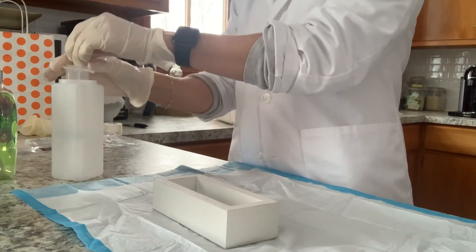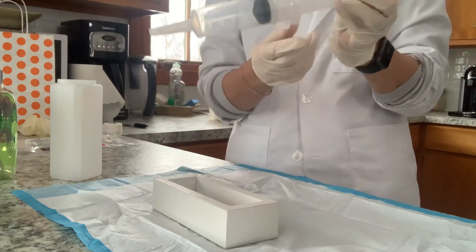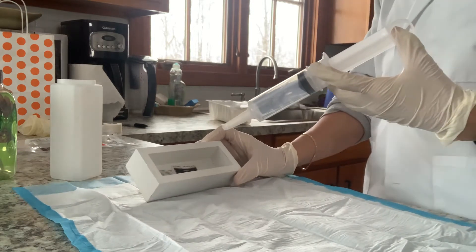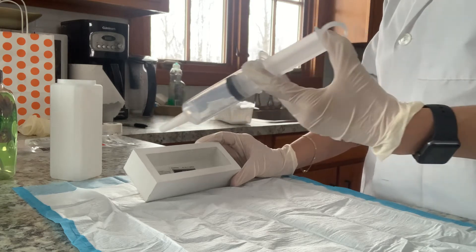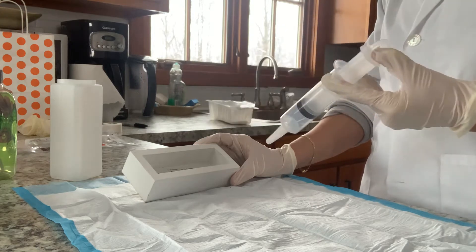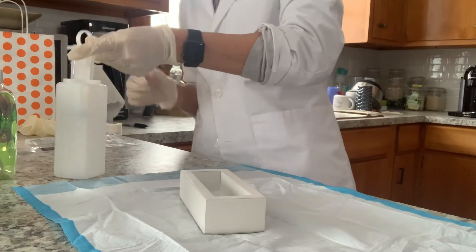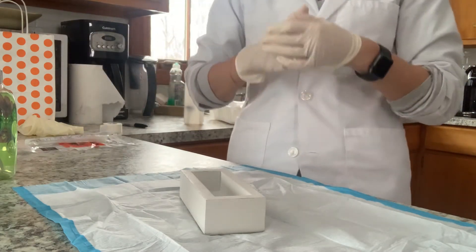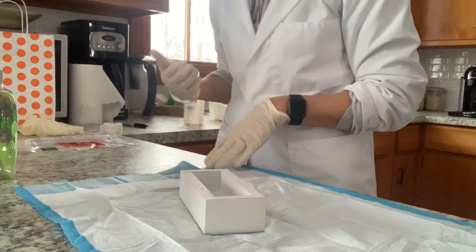So what I would do at this point is pick up the saline and I say the patient is, we'll turn this way so you can kind of see what I'm doing. I would go top to bottom in a zigzag motion until the drainage is clear. And I would be done with that part. Again, I would take my gloves off and I would perform hand hygiene again.